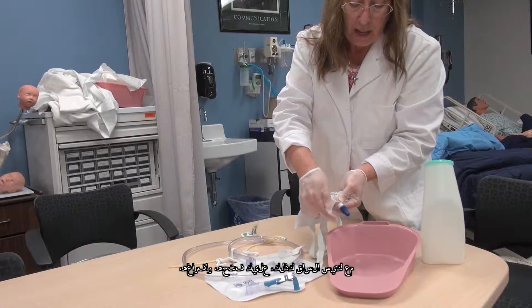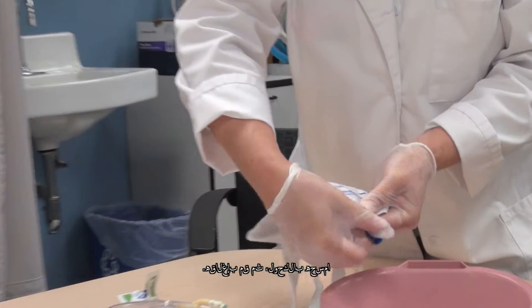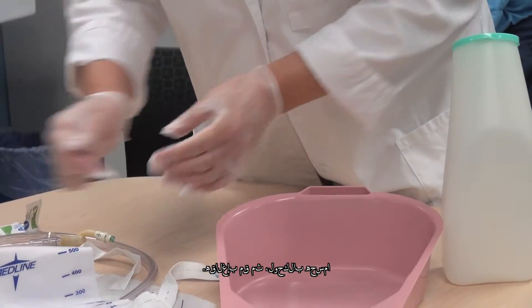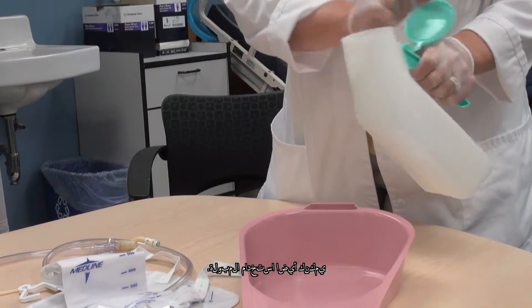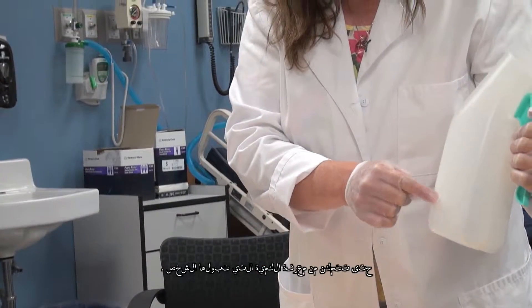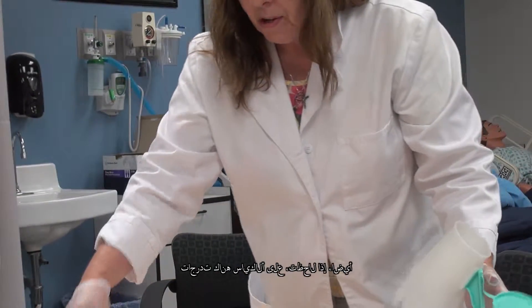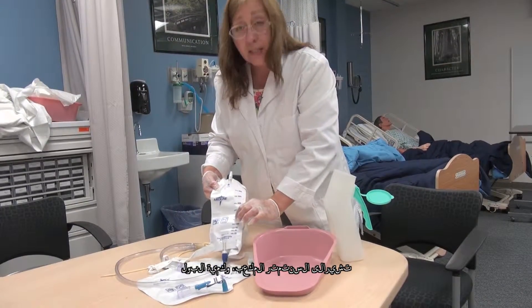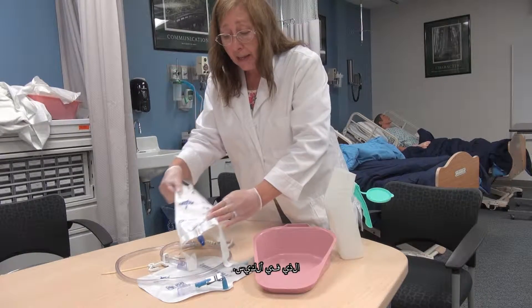You would turn that, empty it, wipe that with alcohol, and then close it back up. This is a urinal. You could also use the urinal because it has measured gradations, so you can know how much the person has been urinating. Also, if you notice on the bags, there are gradations that indicate the CCs — the amount of urine that has been deposited into the bags.